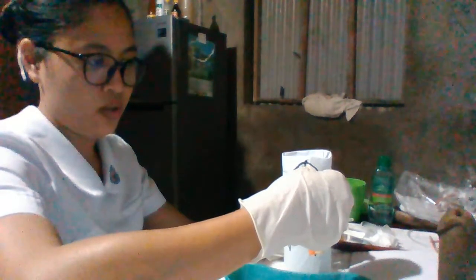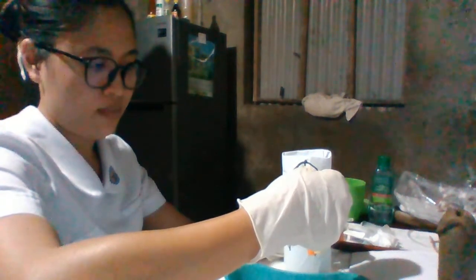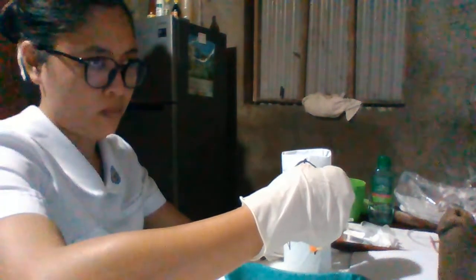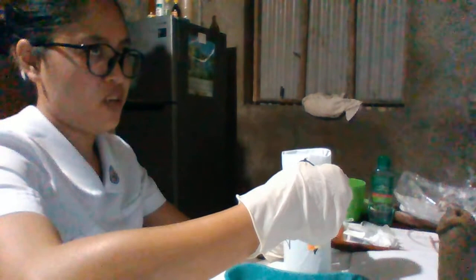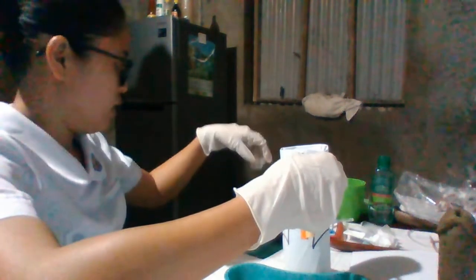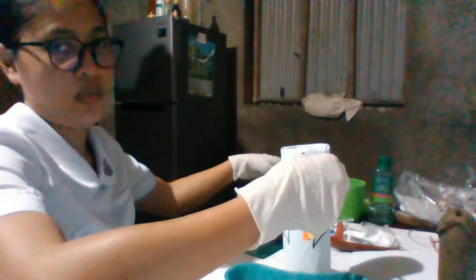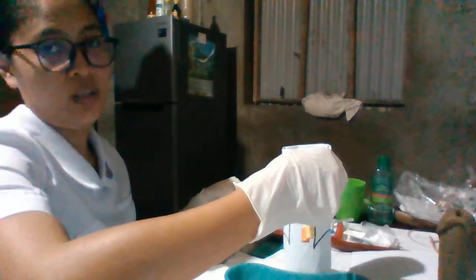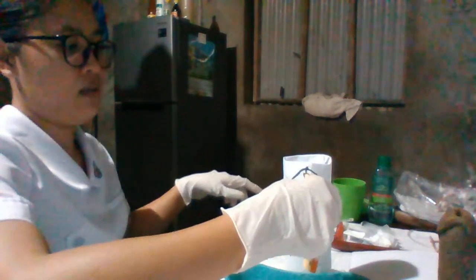We just do this to temporarily stop the urine, then release the catheter to allow the remaining urine in the bladder to drain into the collection tray. And we need to cover the specimen and put it aside.